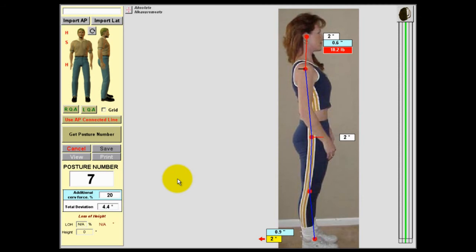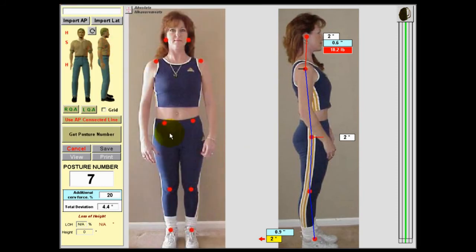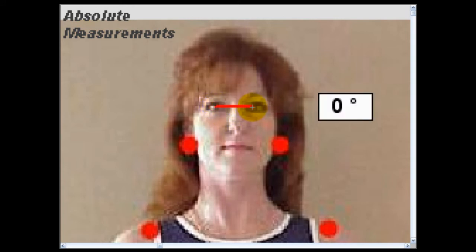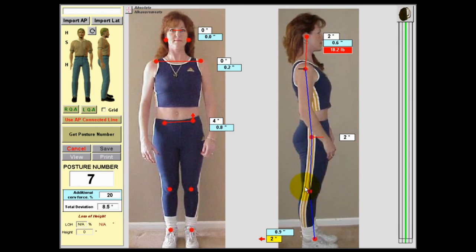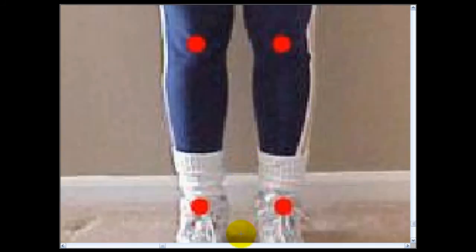That whole process — taking the picture, importing it, and doing the exam — takes about 23 seconds in Posture Pro Touch. We've made similar changes in how the software performs an A to P exam. The most notable change is zooming the picture in even larger than before for a higher degree of accuracy, so we can place the arrow right in the center of the dot. A major change was in the A to P Connected Line, which now operates very similarly to the lateral exam, hyperjumping to the next point to be measured.